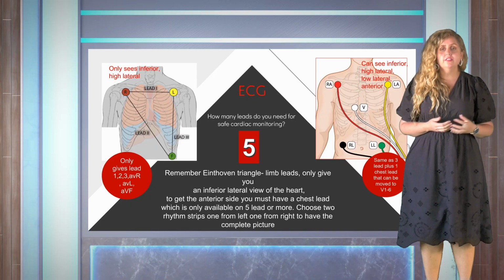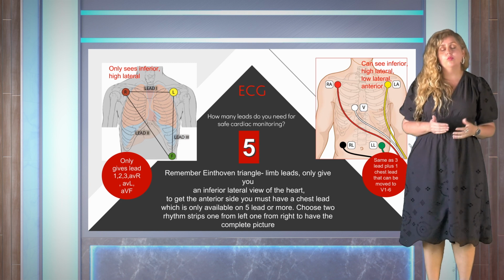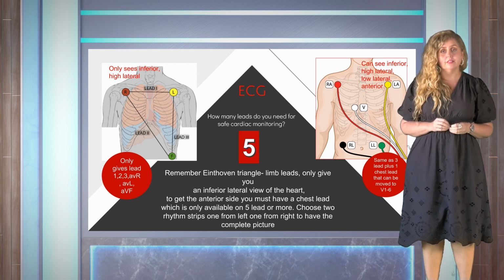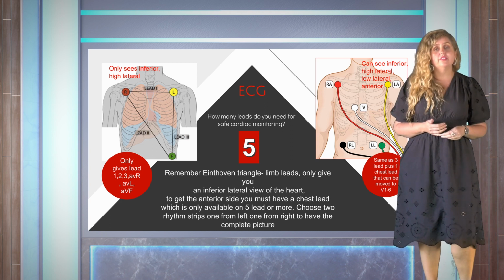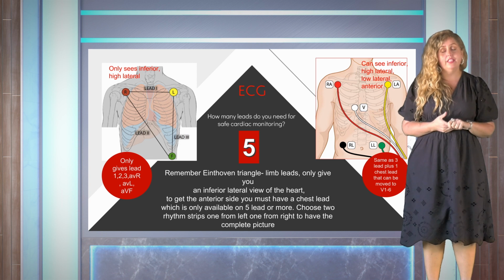All right, and then I thought we'd just touch on some of the other things that we do monitor on the bedside monitor, although they're not strictly hemodynamic, but we definitely monitor ECG. And we've gone into a lot more detail with ECGs in a previous month's video, so please have a look at that if you haven't already. But what I did want to mention today for very practical monitoring purposes is the question, how many leads do you need for safe cardiac monitoring? Because we often see patients being monitored with 3 leads, but it is not adequate. We need 5 leads for cardiac patients.